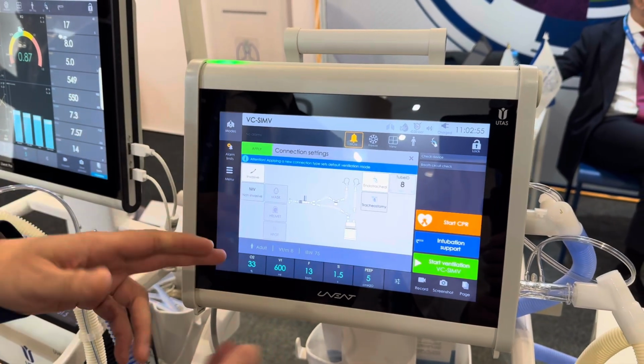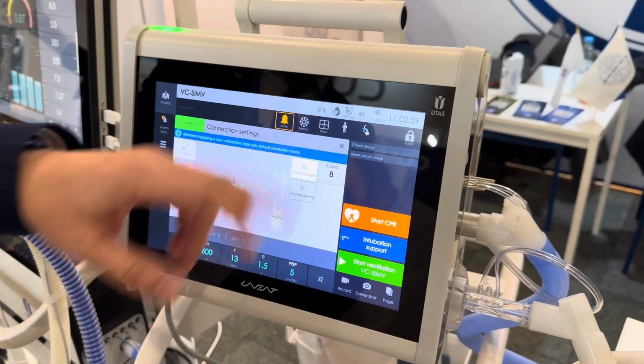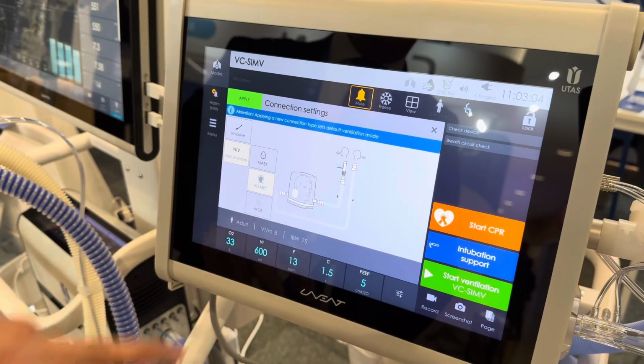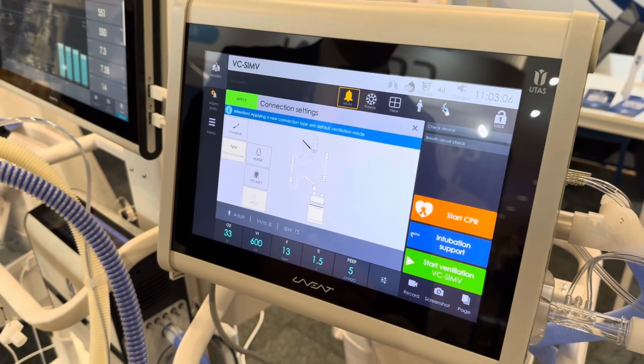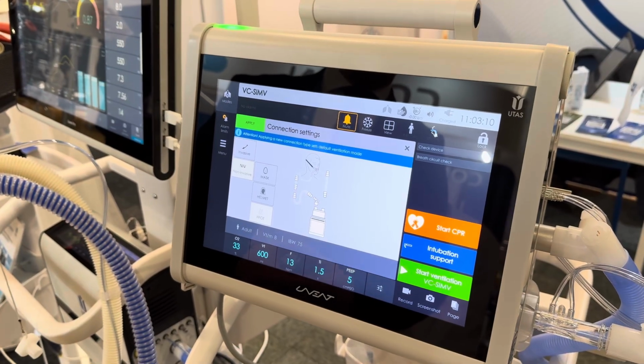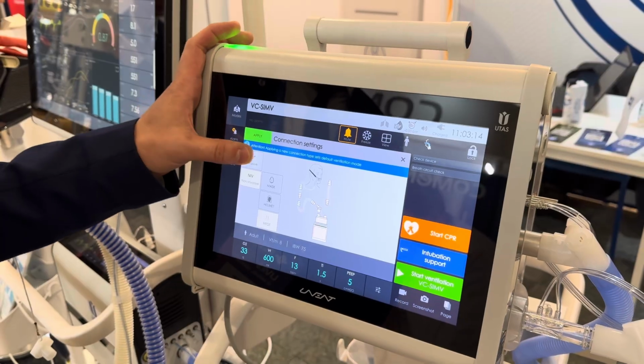We have a possibility to select the type of invasive interface, endotracheal or tracheostomic with its size, and non-invasive interfaces with a mask, with a helmet, and high-flow oxygen therapy. According to a clinical case, the doctor can preset the ventilator to provide proper respiratory support for the patients.